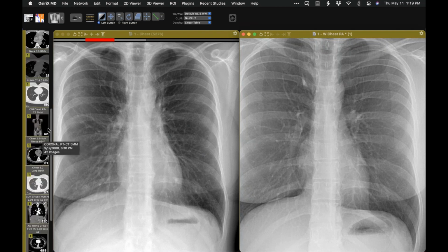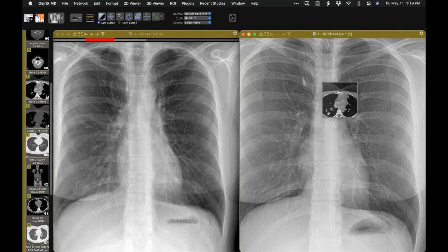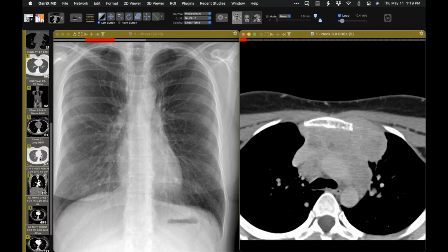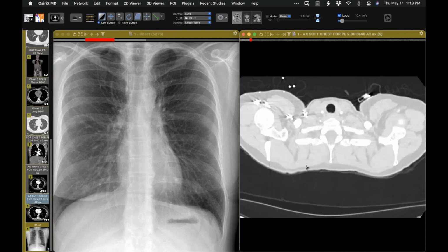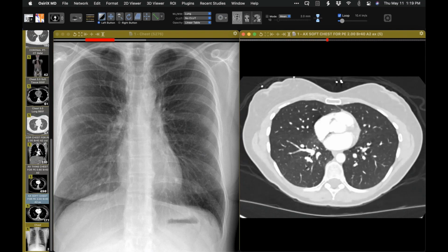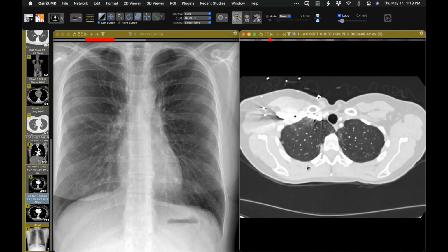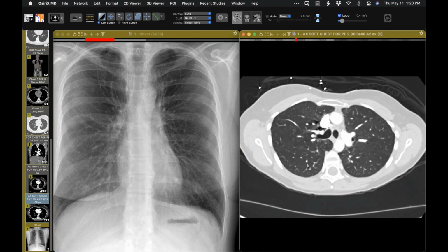So that's kind of cute because this patient has, so I'll put this over there, a history of lymphoma and mantle radiation therapy. So we have radiation fibrosis, and let me just try to find the image that shows the scarring in the upper lobes, the paramediastinal scarring. So it's kind of a fun case to show subtle findings, pretty typical of a sequela of remote mediastinal radiation therapy for lymphoma in this case. So kind of a cute case in that sense.